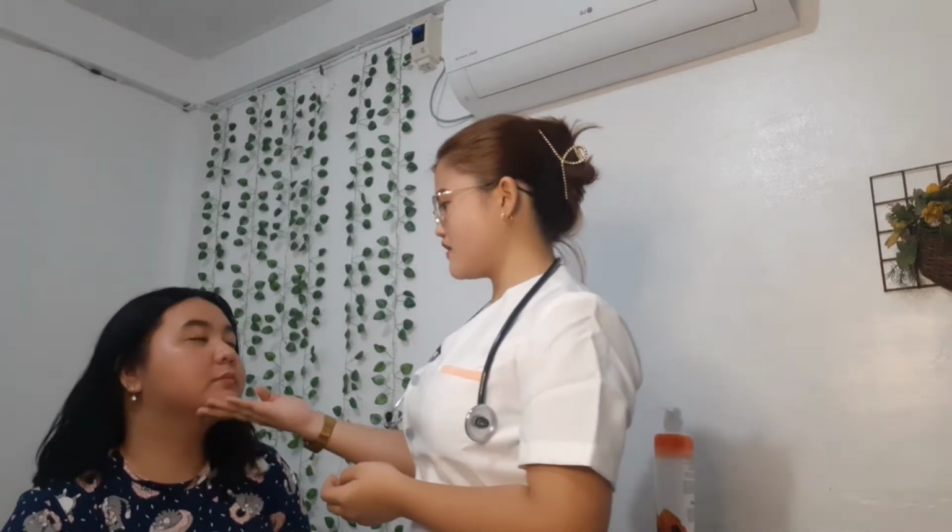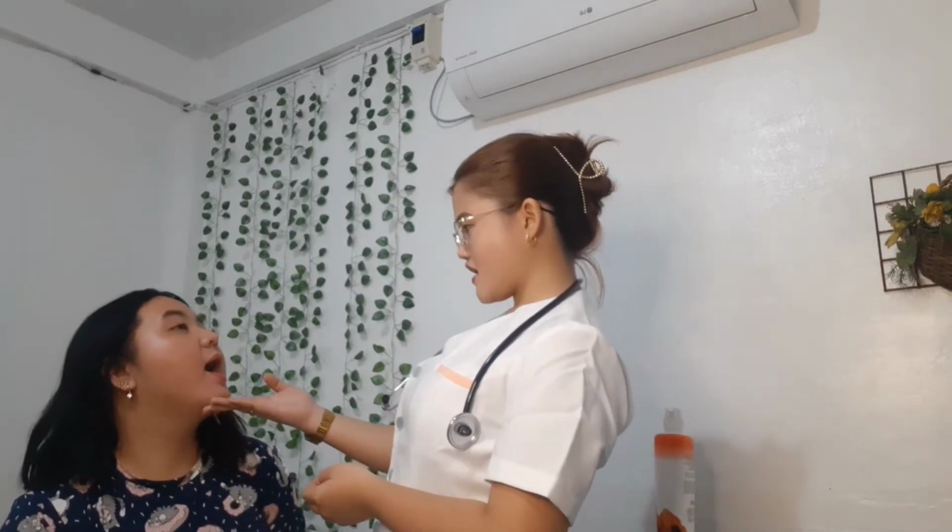Okay. After knowing the history of the patient, the next thing you will do is to assess the client's baseline respiratory signs, including the airway, the respiratory pattern, the rate, the depth, and the rhythm. You need to note if there is any indication of abnormalities in your assessment. The rationale is that it helps to determine the client's need for oxygen as well as response to the therapy. So, ma'am, can you say ah? Okay. I didn't see anything unusual.